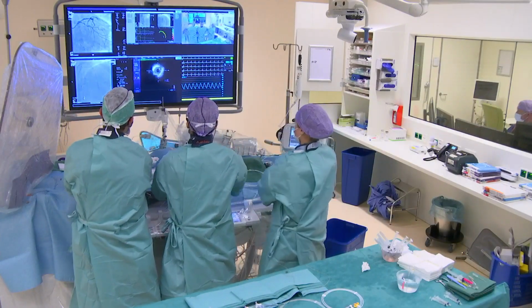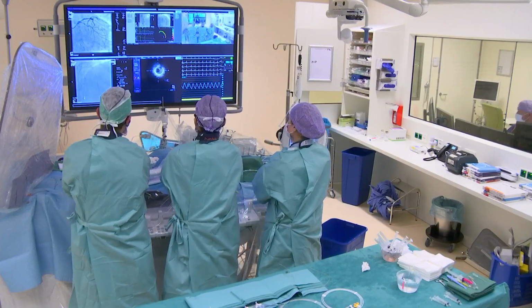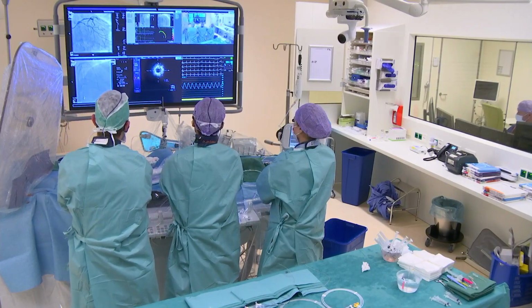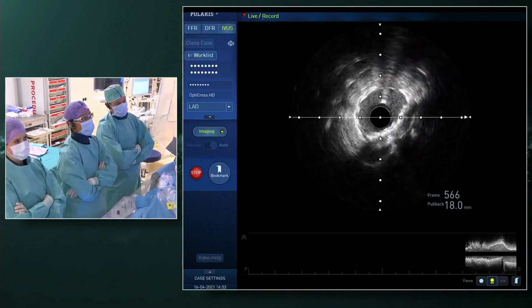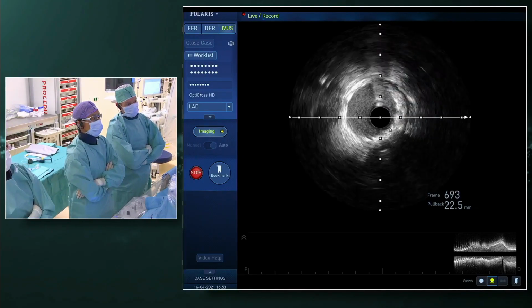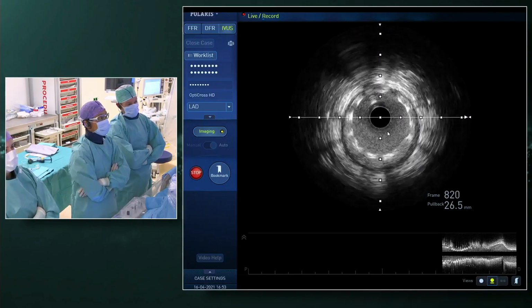So it started distal from the distal stent, of course. The septal branch came in from 9 o'clock. And then first we look at the distal stent. Well, I didn't see an edge dissection. It's nicely round and apposed. And here we still see a bit of eccentricity due to the calcium. The crack was small, but it's there. Here's the proximal part.